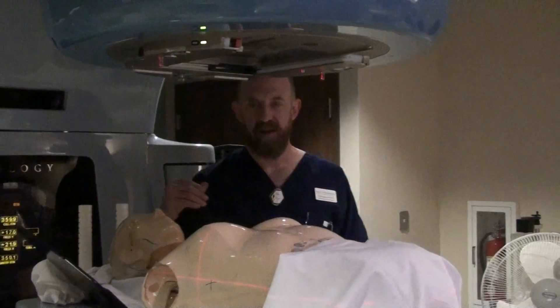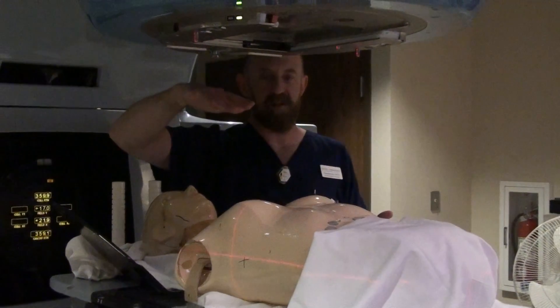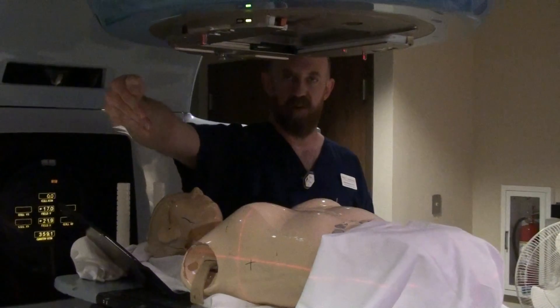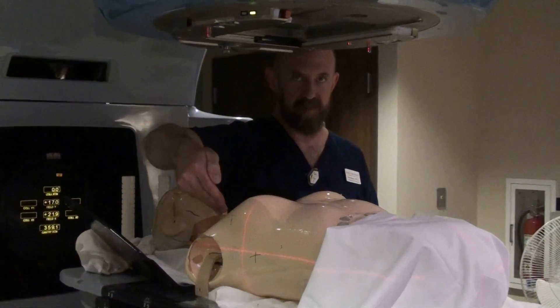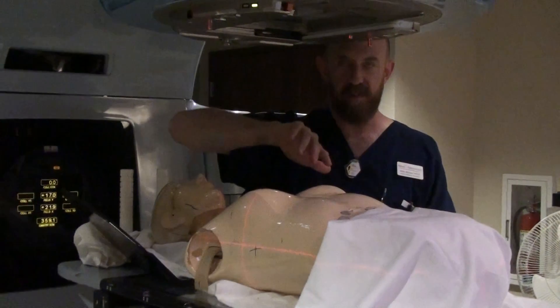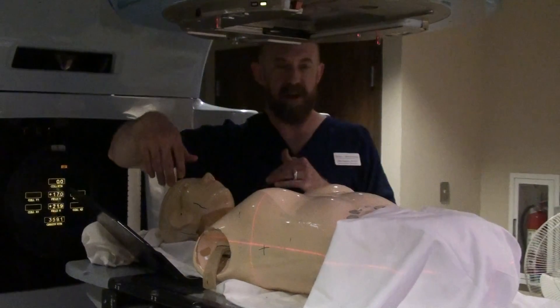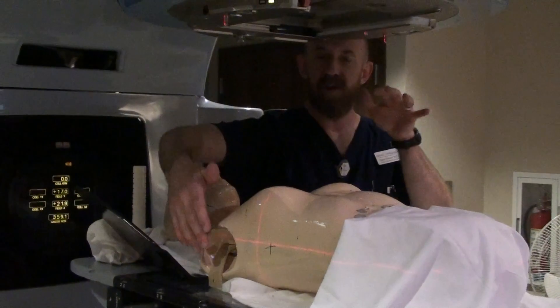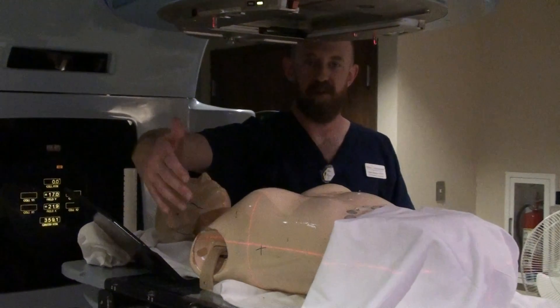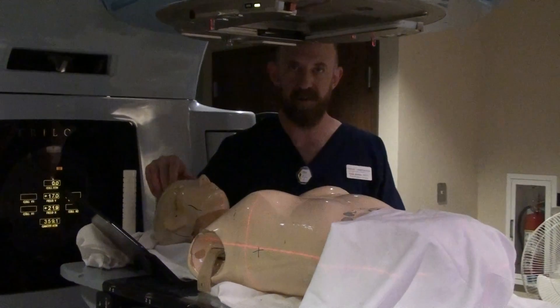You also have the added problem when you need to go off cord or you need to have an angle in — you have to avoid trying to treat through the arms themselves. With the arms up, the arms are out of the way for any angle that you want to treat, whether it's a boost or whether it's IMRT. The arms up and out of the way gives your dosimetry department plenty of leeway in order to treat from any angle necessary. So that concludes lung treatment.